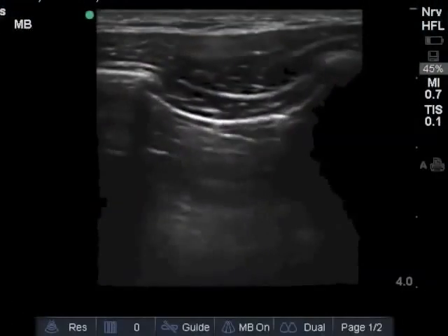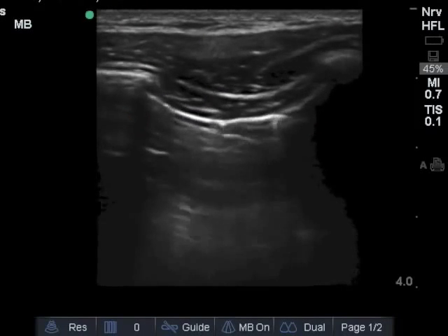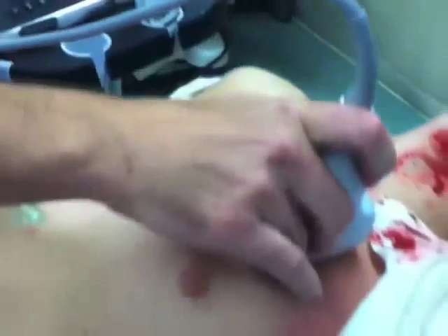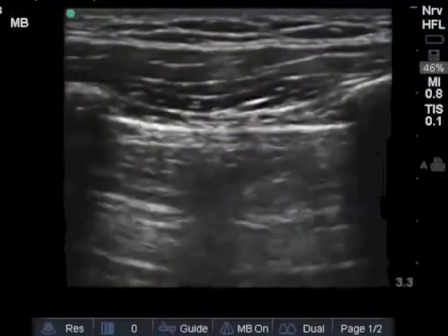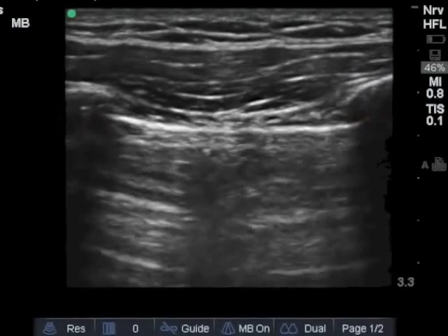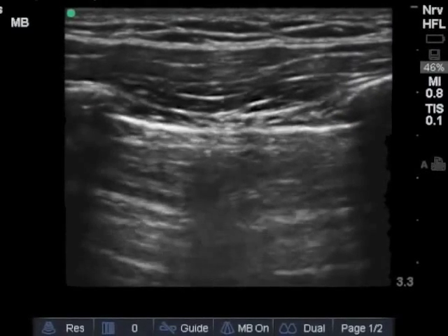To the right chest. Good lung sliding. Waves on a sandy beach. No pneumothorax. Onto the left lung. No lung sliding at all along the pleura. And the barcode sign on M mode. That's a definite pneumothorax. Dr. Zwank's heart rate is up. Call surgery!